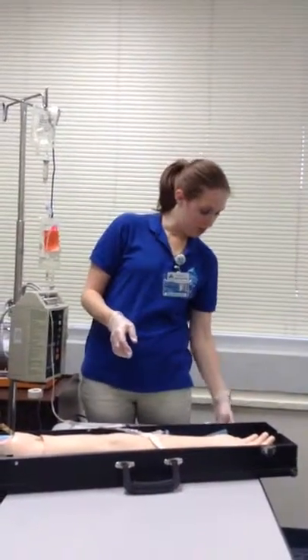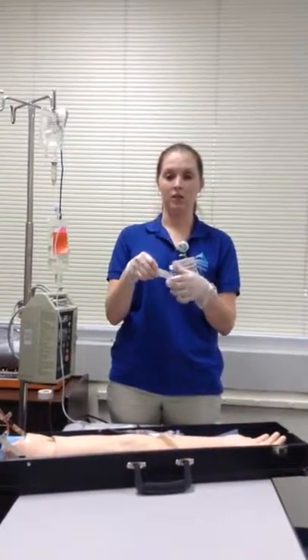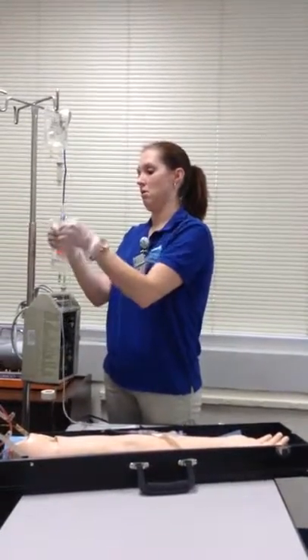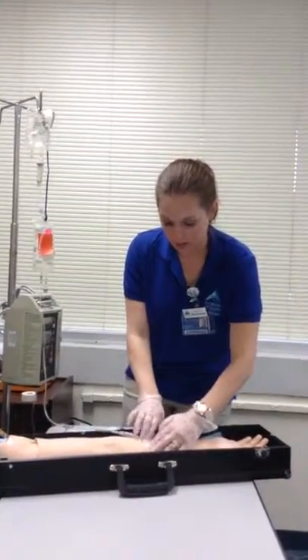Before I would have brought the medication in here for my piggyback, I would have labeled my tubing with the date, time, and my initials. Okay, now that that's going, I'm going to look at her site. Everything looks good. I'm going to come back in here and check on her periodically.